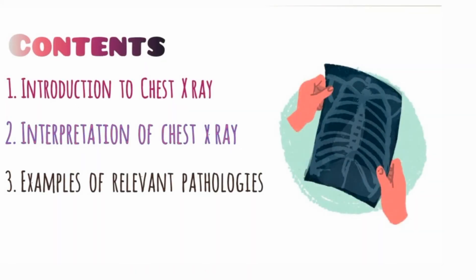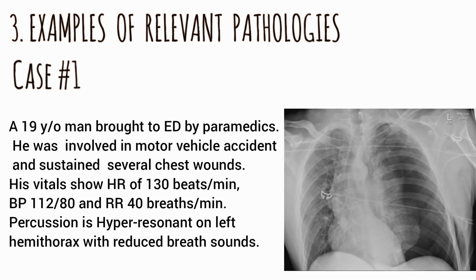We're done with the introduction and interpretation. Now let's move on to examples of lung pathologies in chest trauma. Here's the first scenario — read it thoroughly, try to apply the information to the radiograph, follow the A2H order, and then come up with the diagnosis without jumping to conclusions.